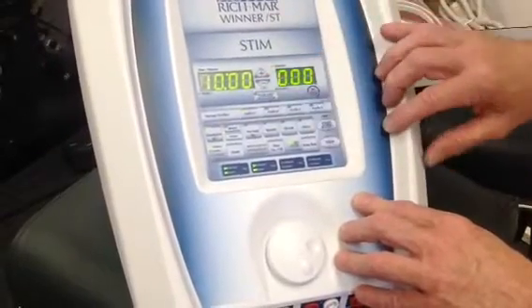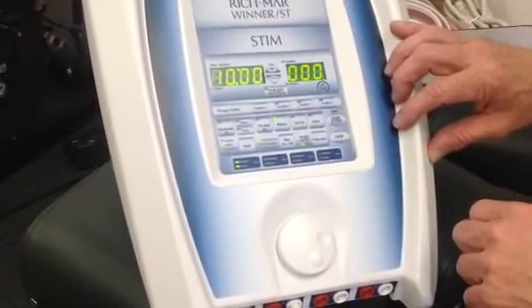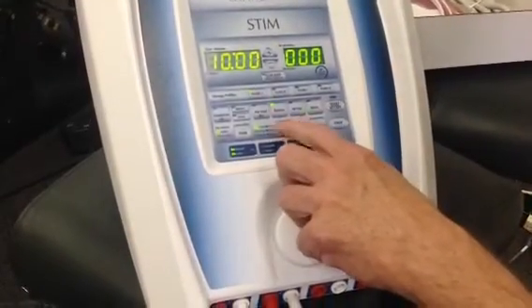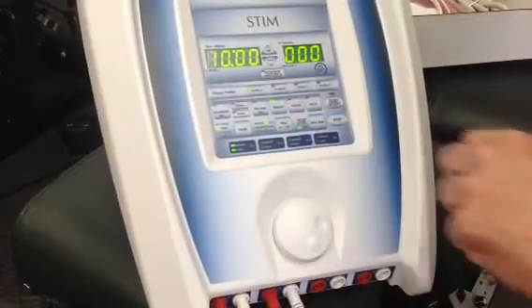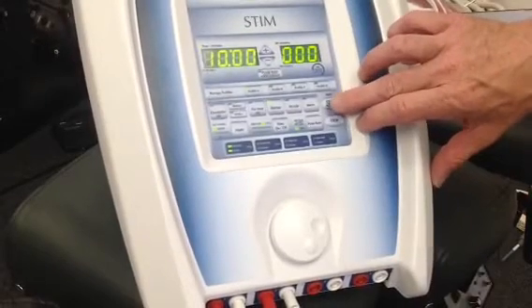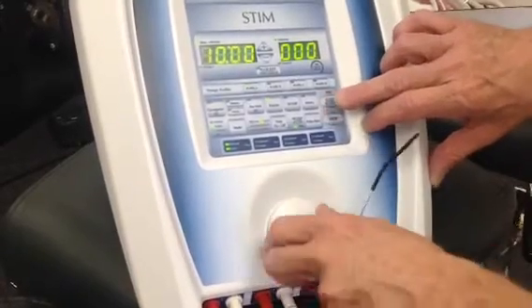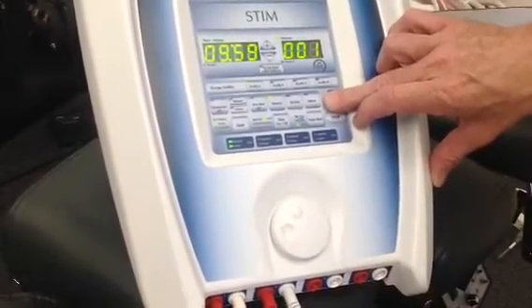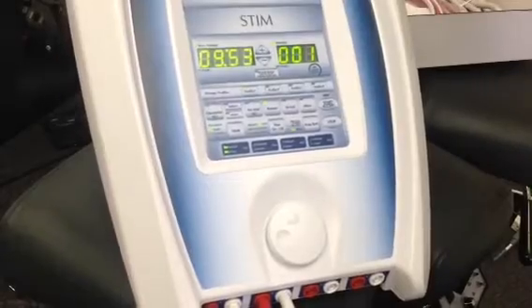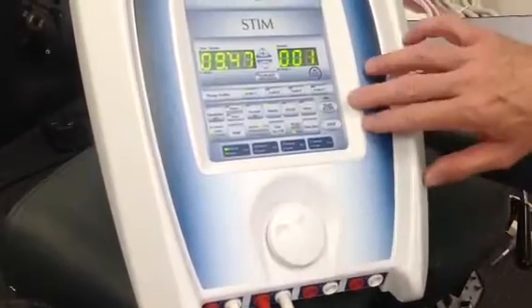I'm going to change the stim time to 10 minutes. I'm going to make program A Russian stim, and I'm going to make it 10 seconds on, 10 seconds off. So you press and hold the Start Accept button. Oh, you've got to turn it up first. Press and hold the Start Accept button for 2 beeps. You do have to turn the intensity up on it before you do that.